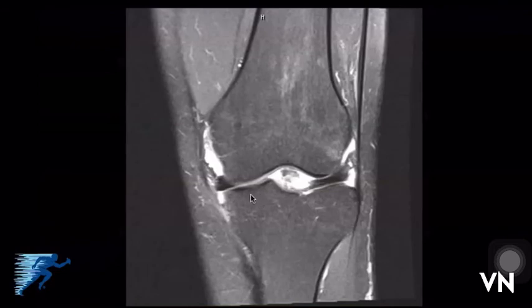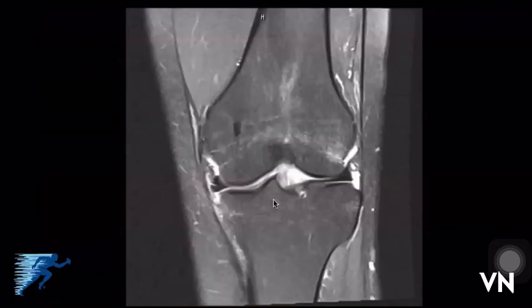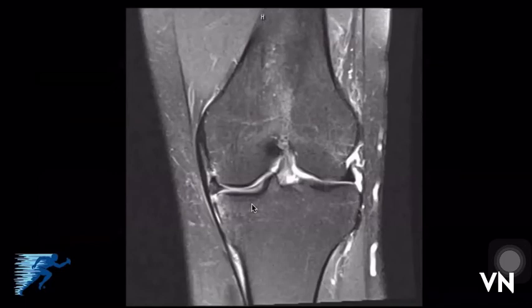As we start to course more posteriorly, we can see the meniscus looks like it's in relatively good position, but now we're starting to see a little bit of increased signal within the body of the meniscus here, which would be indicative of a tear. Here's your medial collateral ligament. This is the deep MCL tibial portion. Here's the femoral portion, the meniscal femoral portion of the deep MCL.